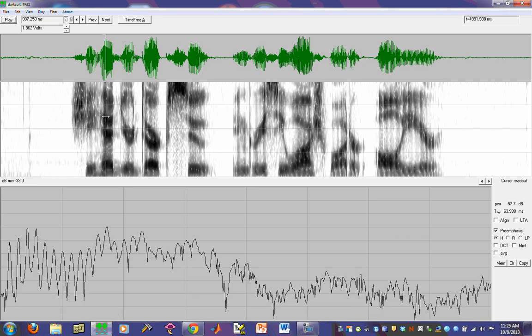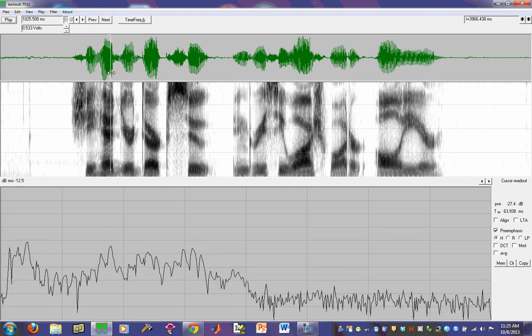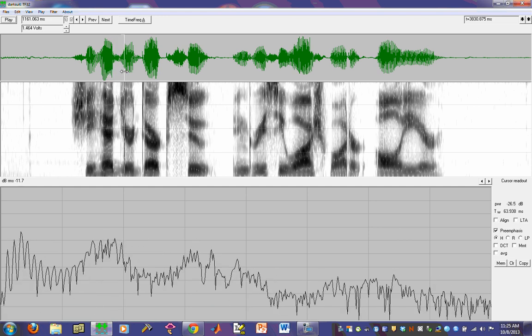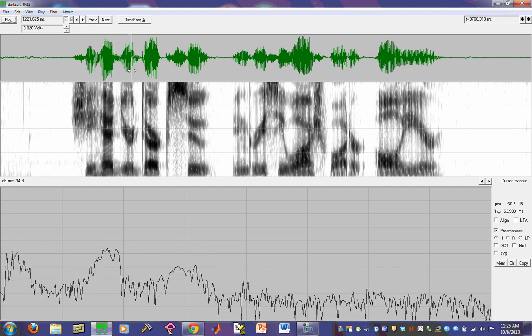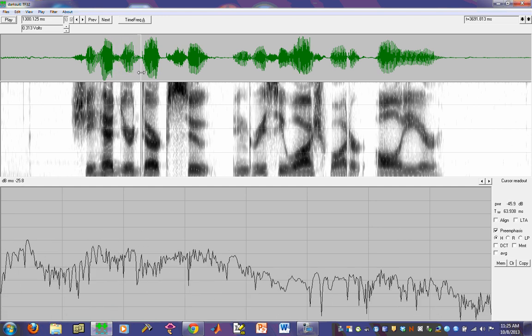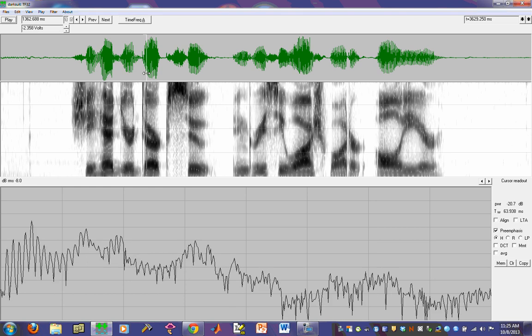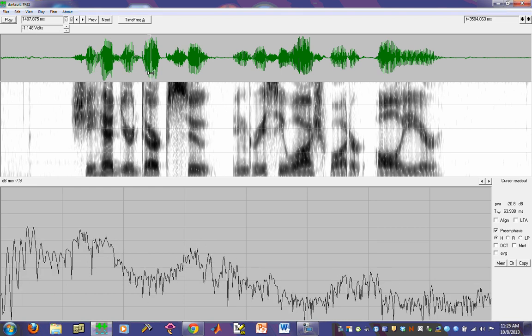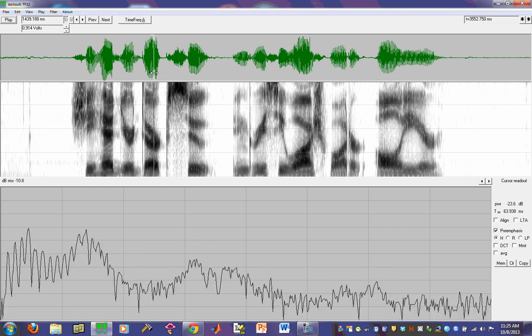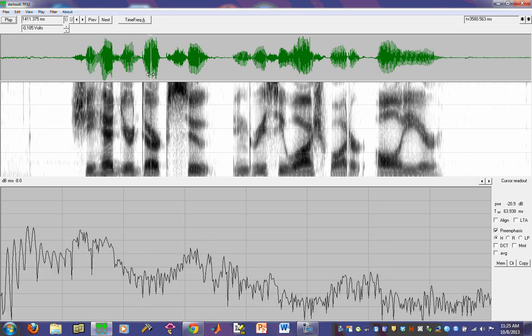Now, if you watch, I'll click a cursor, and you now see that we now have the amplitude spectrum based upon the FFT of the signal at that particular moment. And you can see as I drag this around, the spectrum is changing in its features as we're sliding our way through the speech sample.